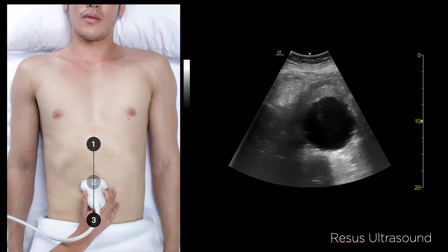Hi everyone. Everybody was curious about how we could scan for Triple-A and not miss a thing, so today I'm going to teach you in about three minutes how we could scan for Triple-A.